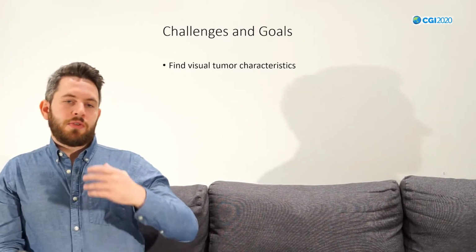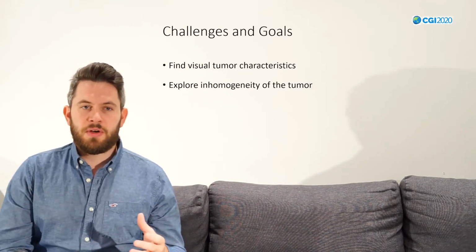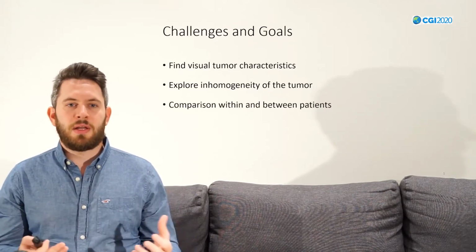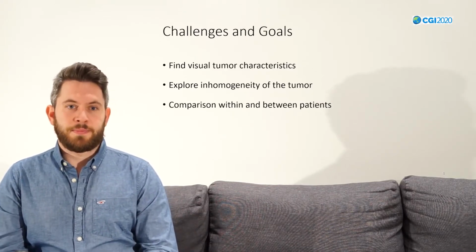They also want to explore the inhomogeneity of the tumor. There's this notion that inhomogeneity of the tumor could be linked to aggressiveness, but this is still an active field of research. So they would like to explore if this is the case. They also would like to compare within patient and between patients. So this should also be possible.